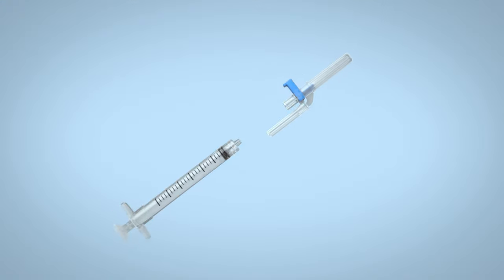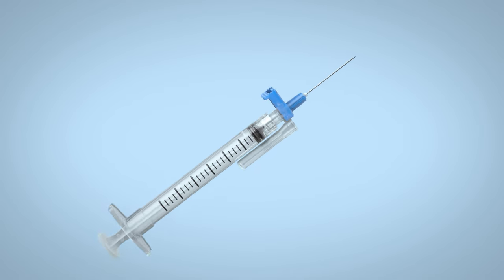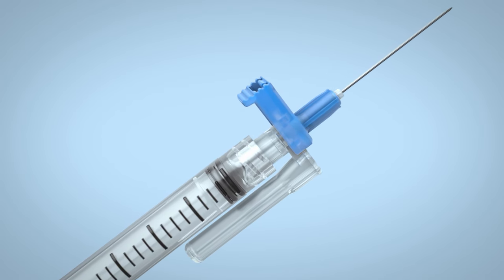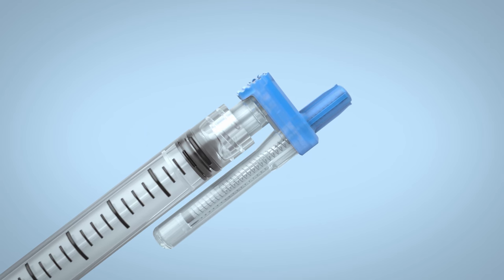The EasyPoint needle features automated retraction technology with the added versatility of a removable lure-fitting needle. Simply pushing the color-coded tab causes the needle to automatically retract into the safety chamber, effectively reducing the risk of needle stick injuries.